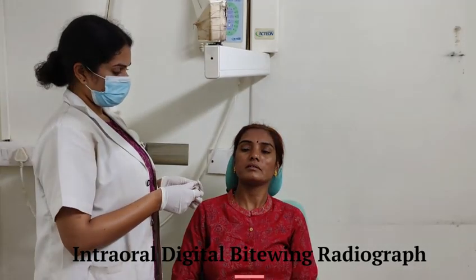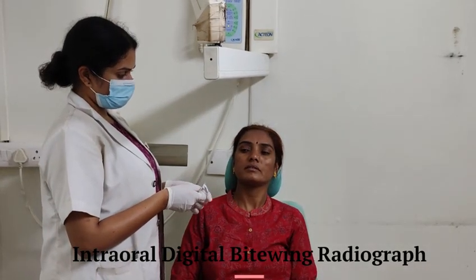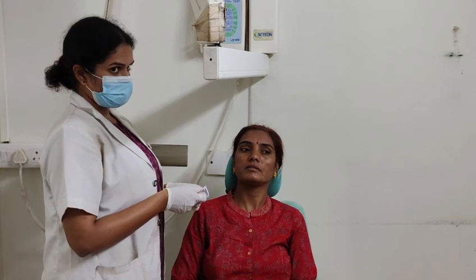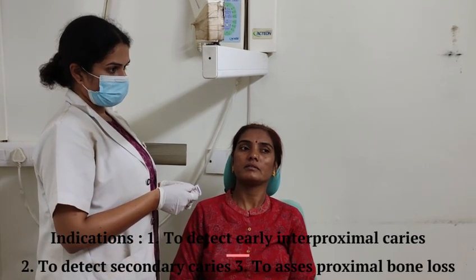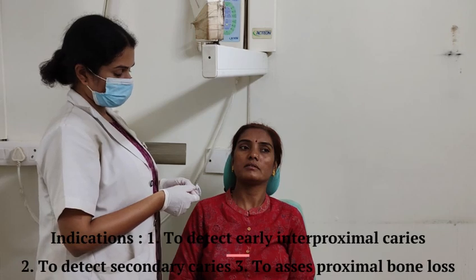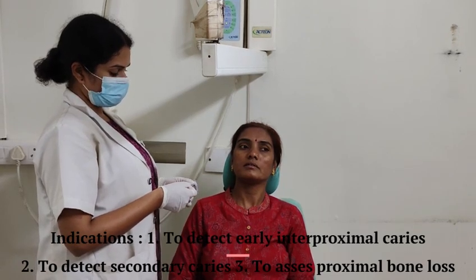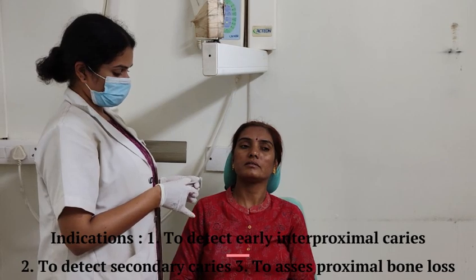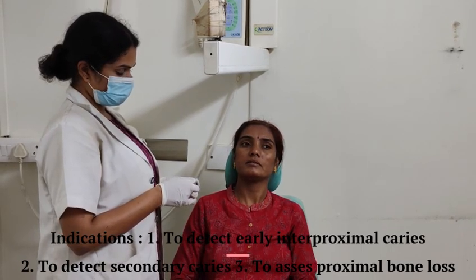Here we are demonstrating the intraoral digital bite-wing radiograph. The indications of this radiograph are as follows: to detect early interproximal caries before it becomes clinically apparent, to detect secondary caries below restorations, and to assess the loss of interdental and furcation bone.